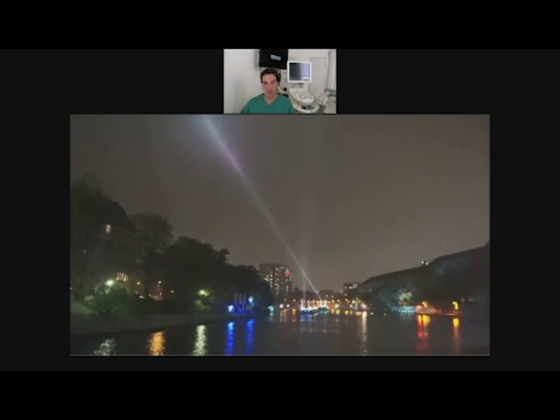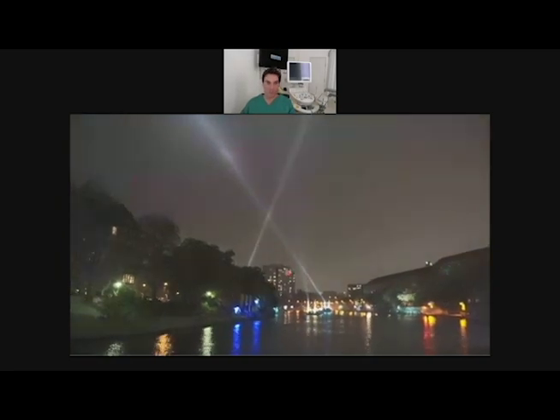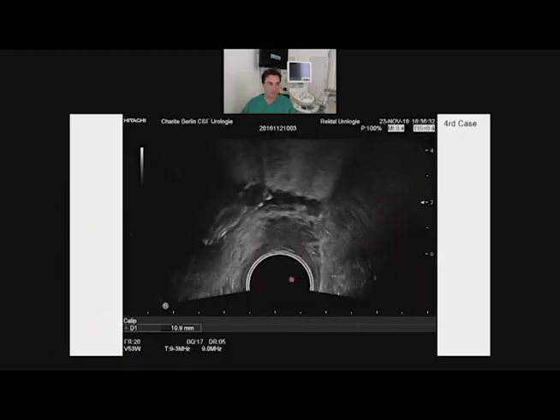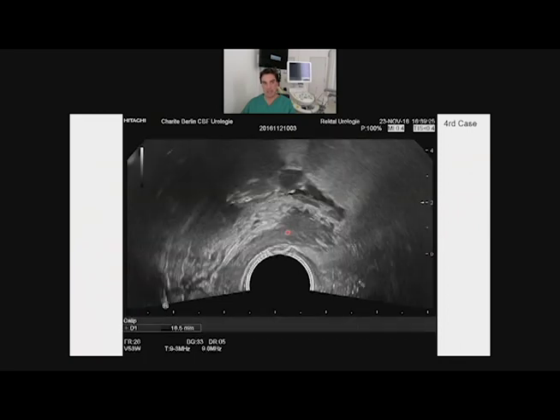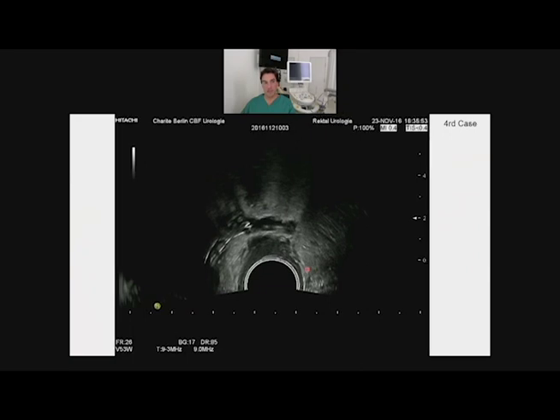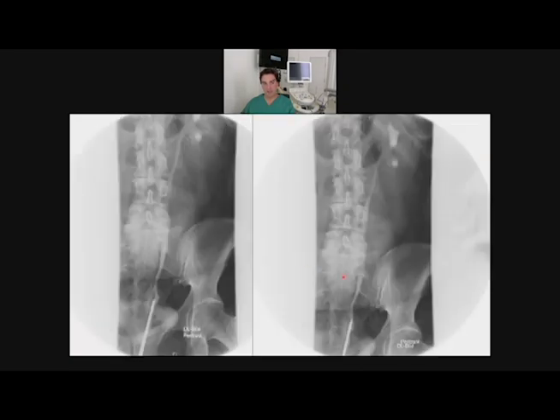Okay, follow-up. This is a view near my flat, and it is a nice part of Berlin. You see it now. This is the part that we bridge. Here, the stent end goes to the bladder. This is the bridging part. There is free fluid around now because it's one day later. And at the end, if you check it 2 months later, it will come all together.